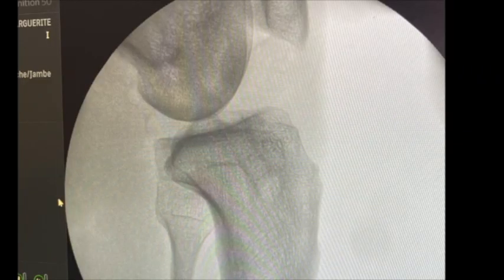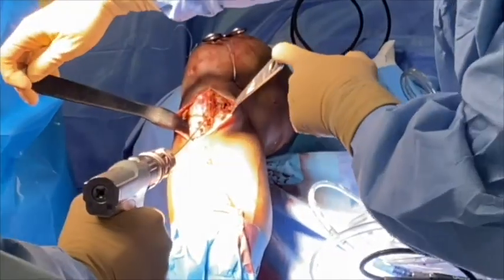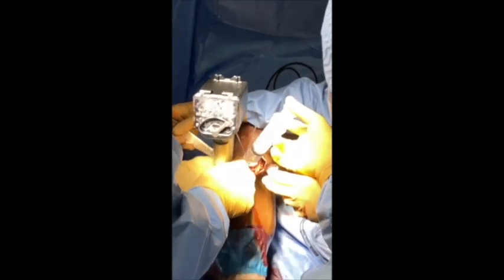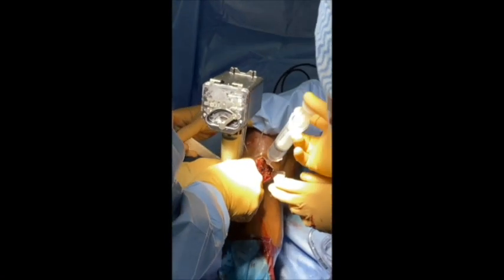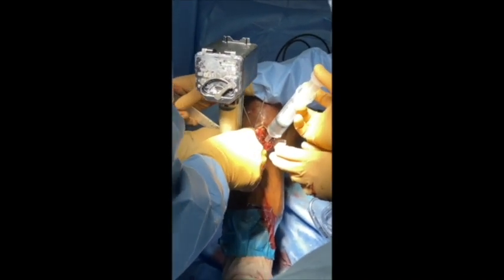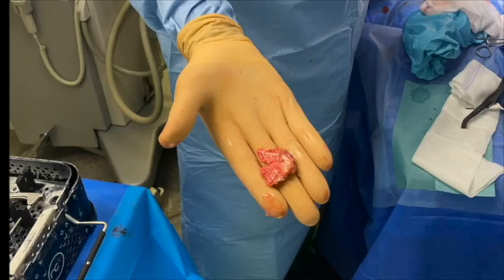The X-ray on the lateral view needs to be perfect before putting the X-ray, with the complete superimposition of the two condyles. We then shoot 2 ascending pins positioned distally onto the tibial tubercle that will help us to drive the saw blade ascending from this anterior point to the insertion of the PCL, that is the hinge point for the rotation of the osteotomy.